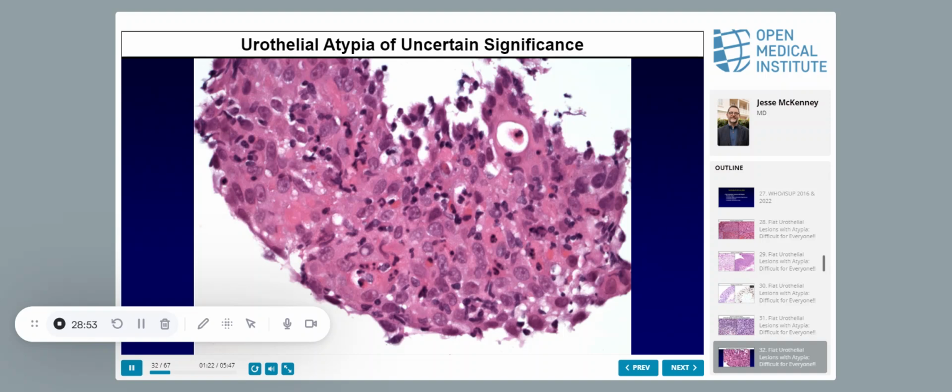But you have to make sure that your threshold for low grade and high grade was reset in 1998. And some people are still being taught what we were doing in 1973. So the threshold for high grade was moved way down.